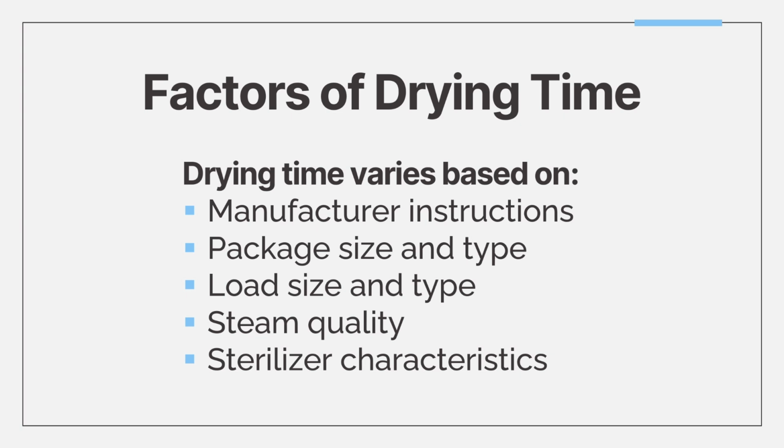So a very popular supplier of sterilizers, especially steam sterilizers, would be Steris. We would always have Steris service technicians coming in to maintain the sterilizer to check that all the pipes are working, there's nothing going on, right?